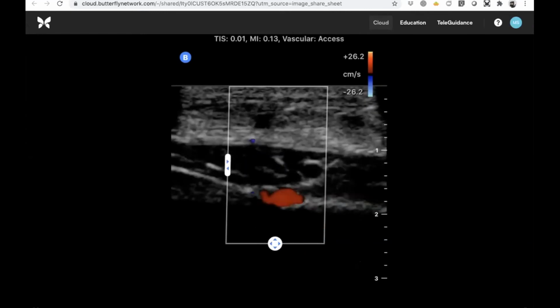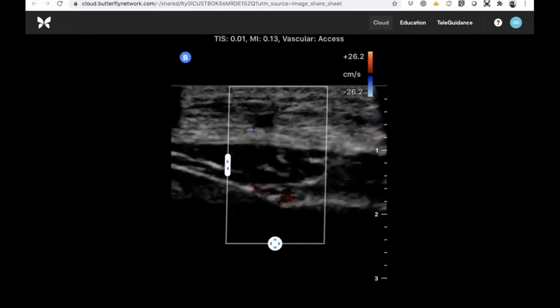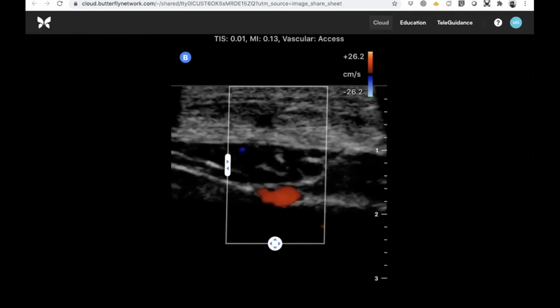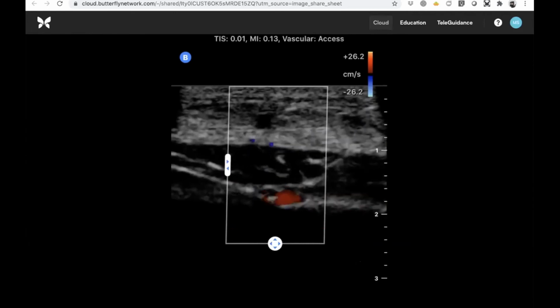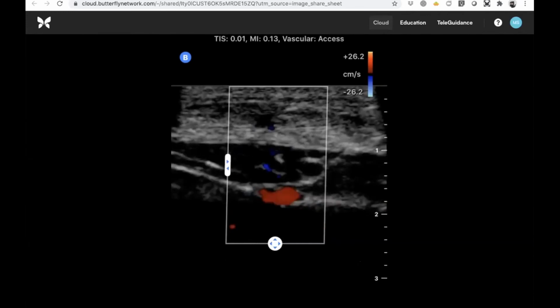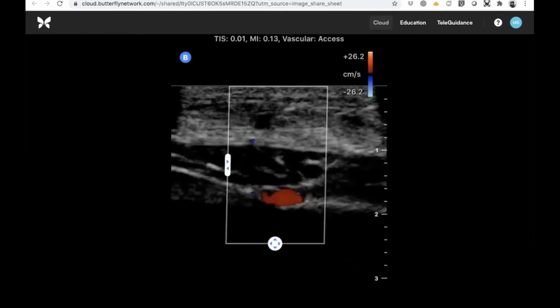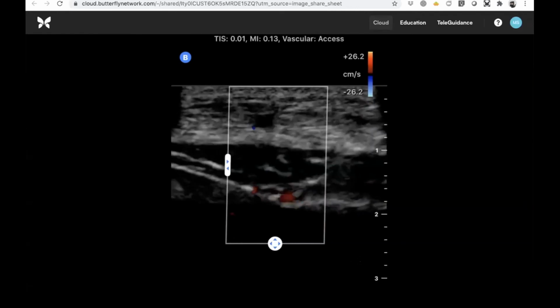So, ascites patients, cirrhotics with ascites, generally their platelets are not the best and their coagulation is not the best. And if you can avoid accidentally sticking one of the superficial vessels in the abdominal wall before you get to the abdomen, that's a plus. So I like this. Any tips on this? Is this something you do before paracentesis, Rachel?